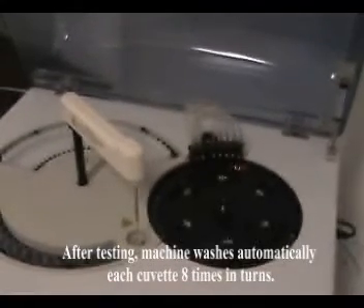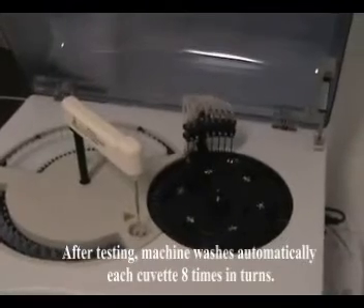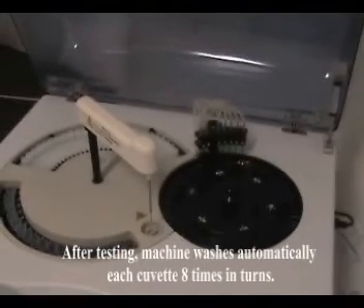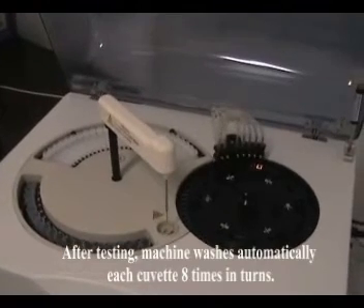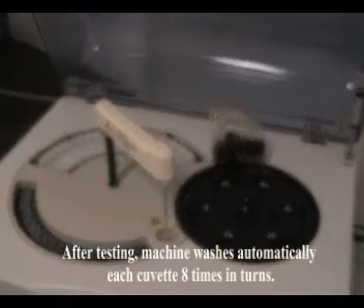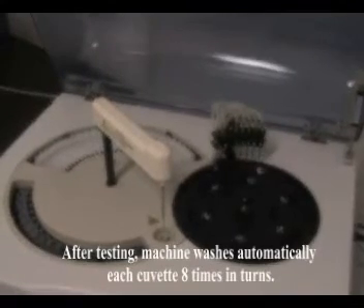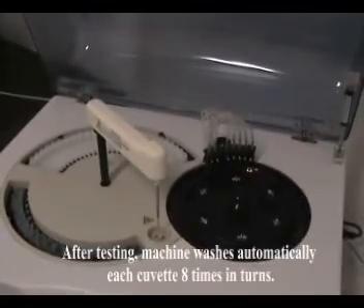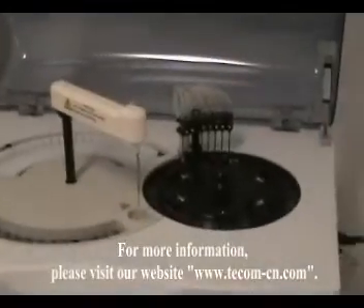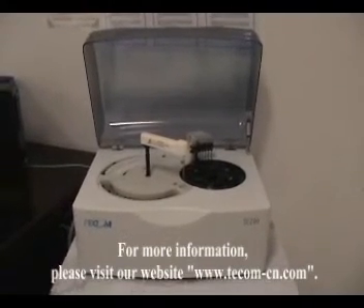After testing, the machine washes automatically — each cuvette 8 times in turns. For more information, please visit our website. Thank you.